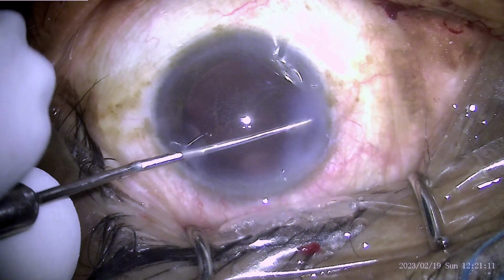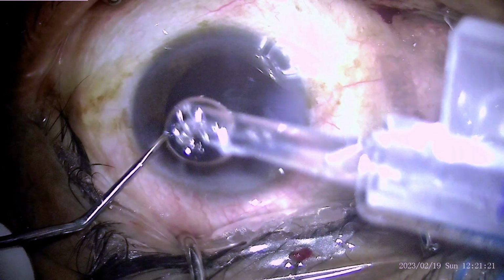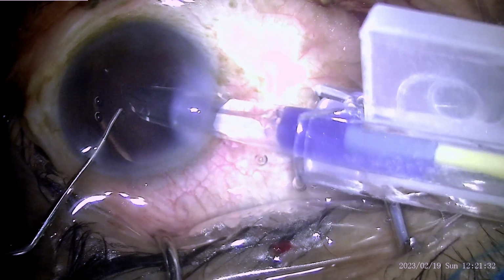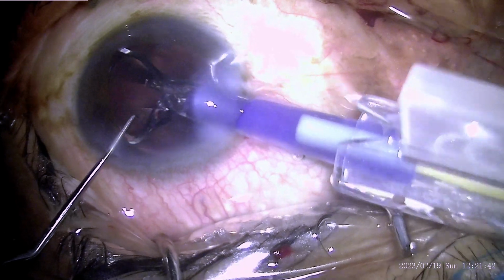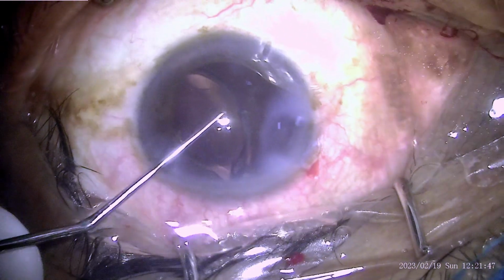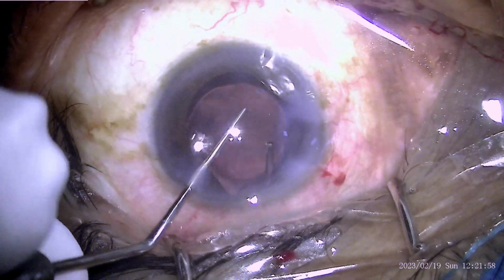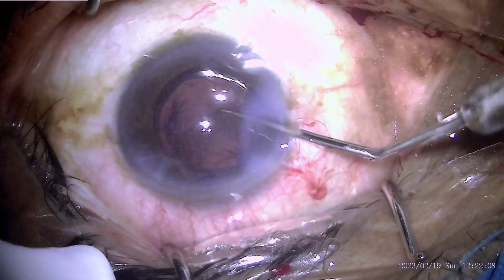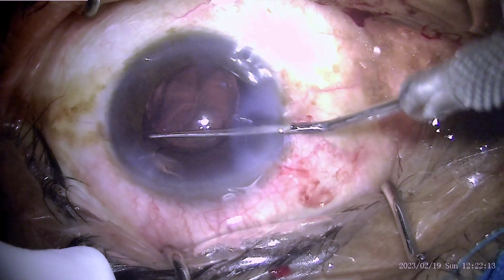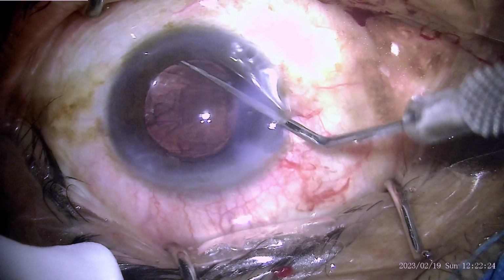So how to proceed then, because most of the cortex has been aspirated out, so one has to clear the vitreous as much as possible from the wound and sweep, using a dialer, the vitreous which is bridging across into the wound and place the IOL in the sulcus as planned. It's a small PC rent, so it will not bother the centration or stability of the IOL. Now once the leading haptic goes into the sulcus, the trailing haptic also can be dialed into the sulcus, and we can see the IOL is nicely centered and in place.